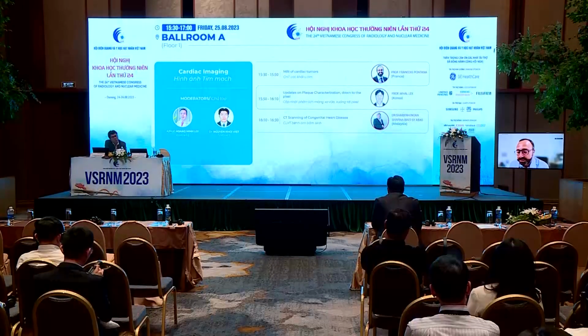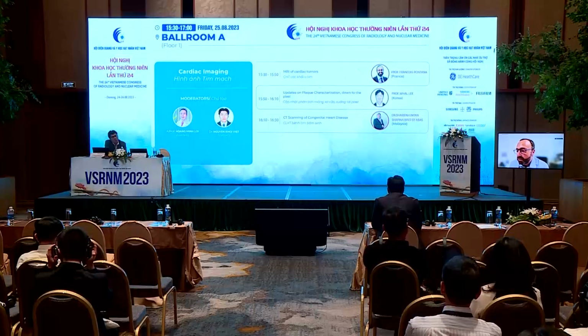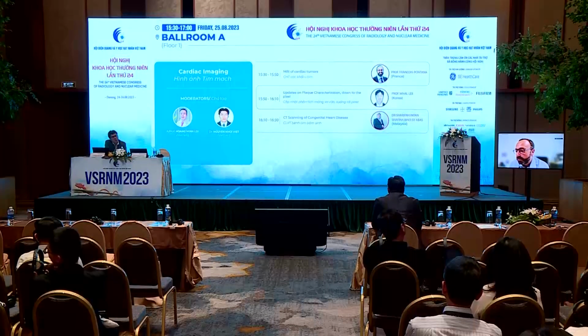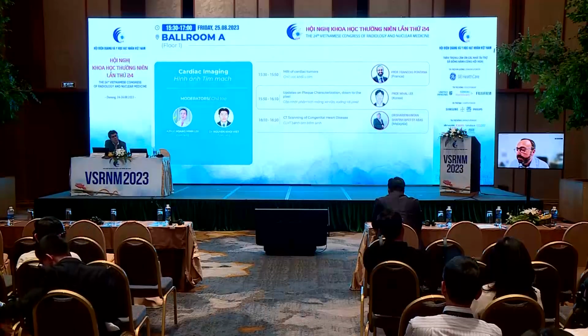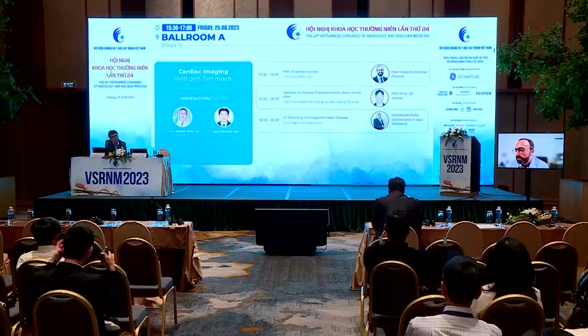It's recommended to have a certain number of normal patients or volunteers scanned on your machine to evaluate the normal values of T1 and T2. We know that T2 is more stable between different machines.